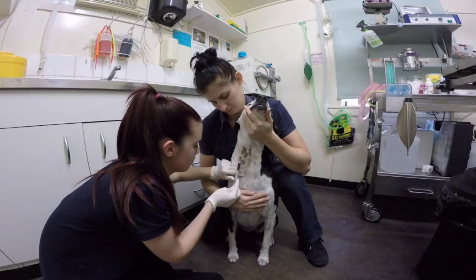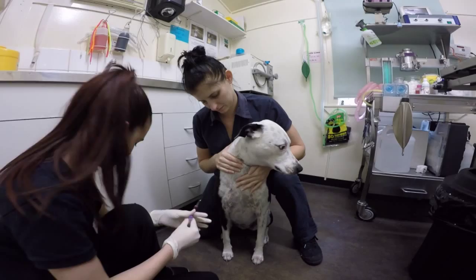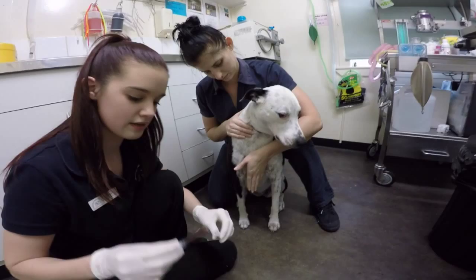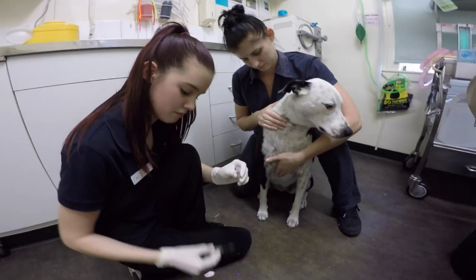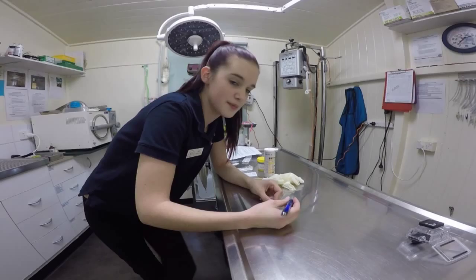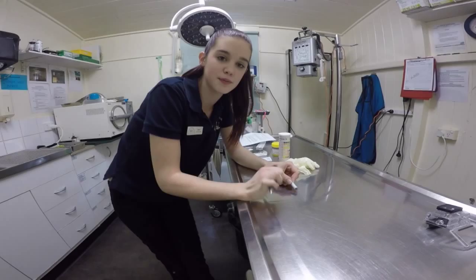Now that I have 2.5 to 3ml of blood I will take the needle out and Nicole will place her finger over the injection spot. I will put my cap over my needle, take the needle off, and put the blood into the EDTA tube. I will now invert the tube 3 times. It's important that the animal's details and the date are always written onto the blood sample.